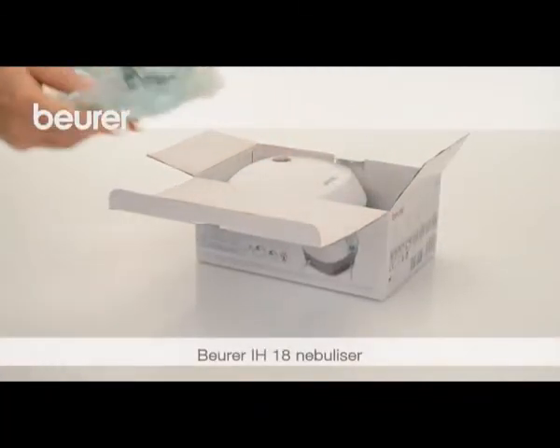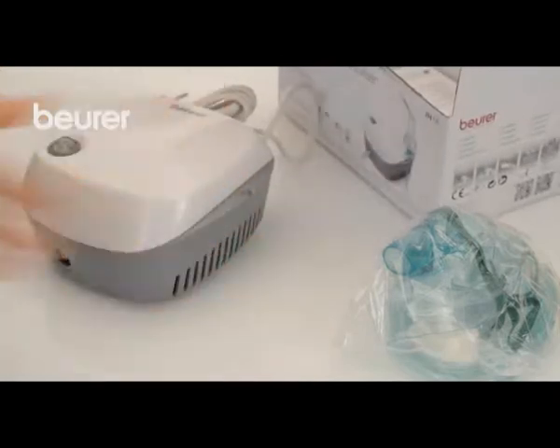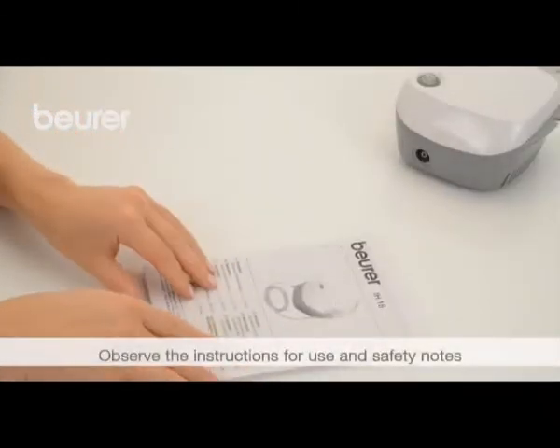Here are some tips on using your IH18 nebulizer from Beurer. Pay attention to the instructions for use and safety notes.